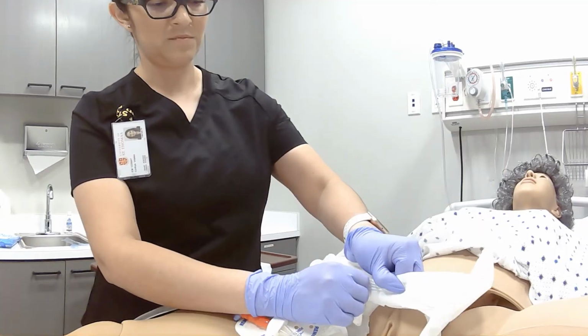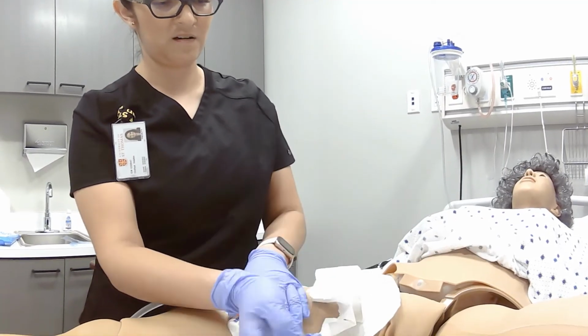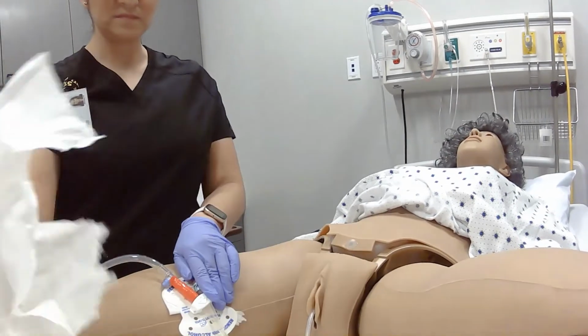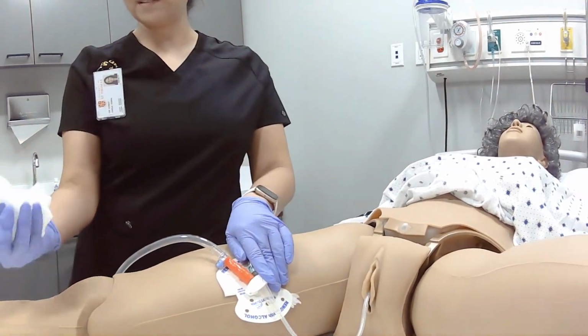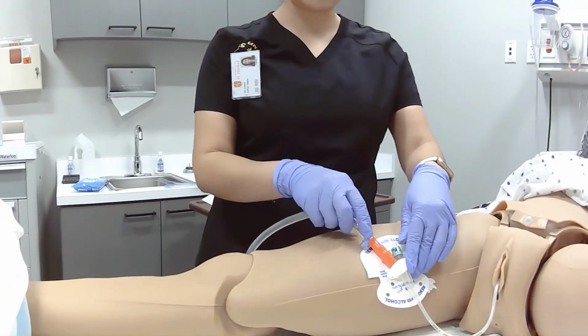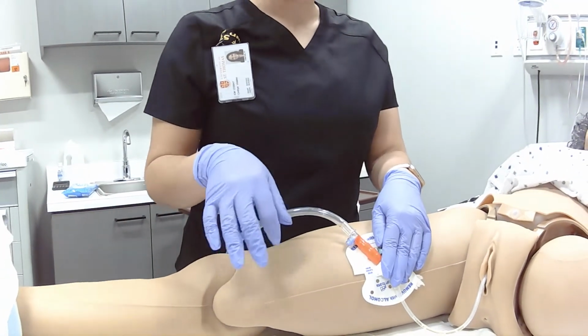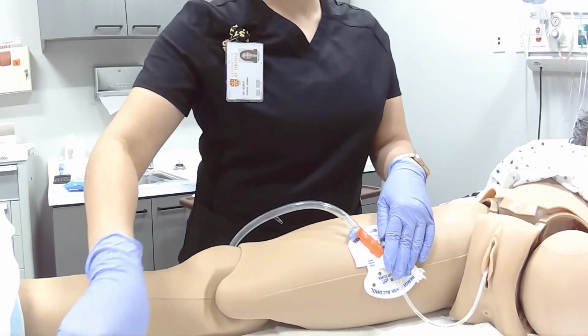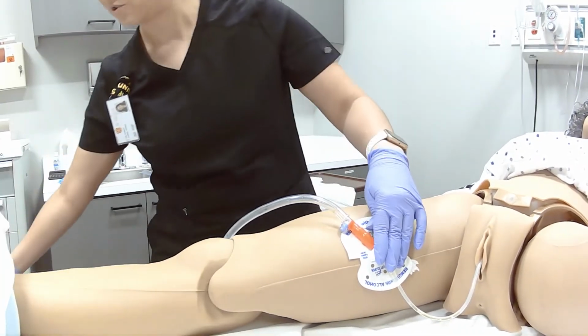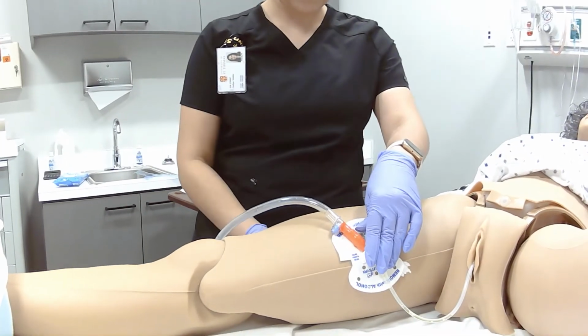So I'm going to remove this, tear that off. But for lab purposes, you're going to be reusing the supplies here, so we will not be throwing that away or tearing it off. We're just going to put this all in the trash so we can throw it away.